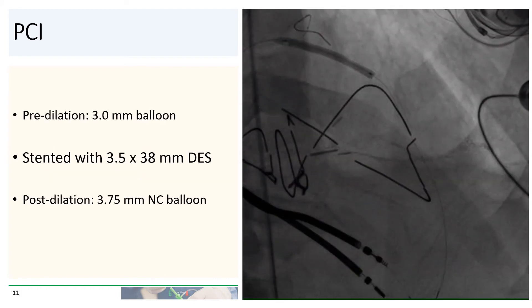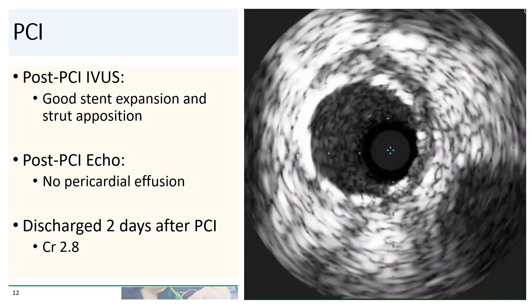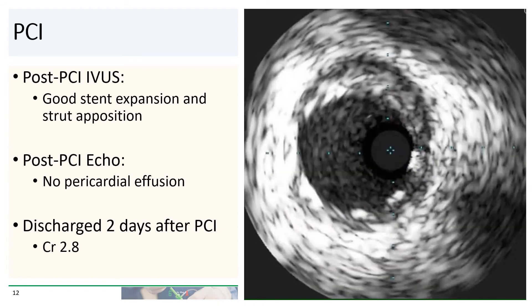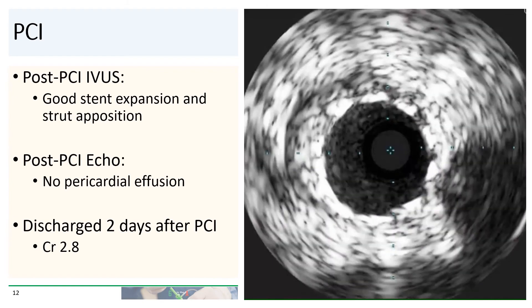The lesion was then dilated with a 3.0 millimeter compliant balloon, stented with a 3.5 by 38 millimeter DES, and we post-dilated with a 3.75 millimeter NC balloon. Post-PCI IVUS showed good stent expansion and strut apposition throughout, and there was no obvious evidence of edge dissection.